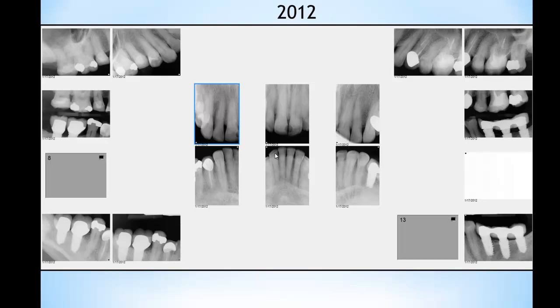You can see also my progress as a Cerec doctor. I became a Cerec doctor in 2007. You see some restorative stage when I was in the red cam, now it's blue cam, and I can see my transformation as a dentist, also how I started this case, how to approach the case, how my preps are, and also what my restorations look like after 5 years of experience.